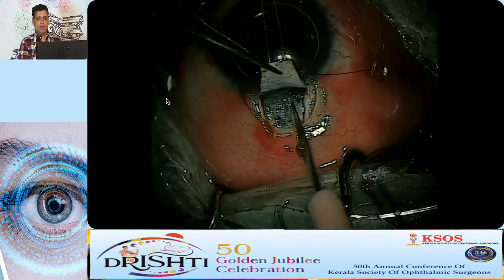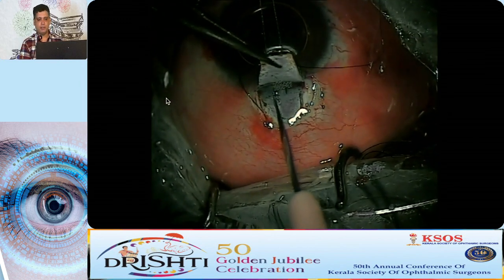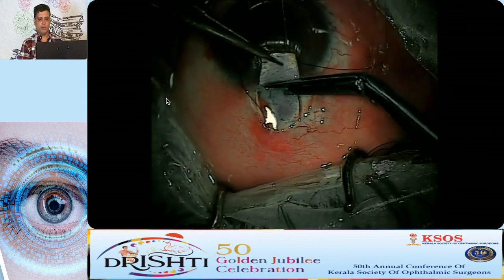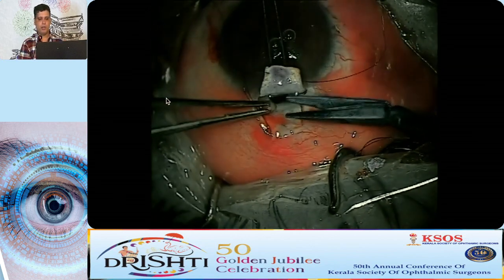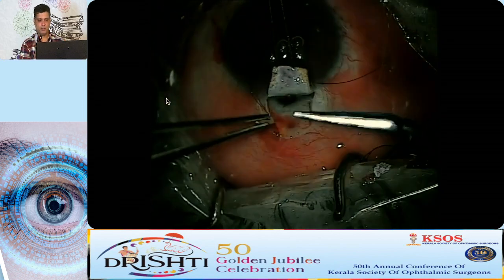Now, cutting the scleral block, again, various methods, traditionally the punch dissection, but here I am using a sharp MVR blade or a sharp sideport blade to make two side cuts and an angled Vannas to cut the scleral block. I find this a very reproducible technique to cut the scleral block. You can basically control the dimensions very easily by this method.